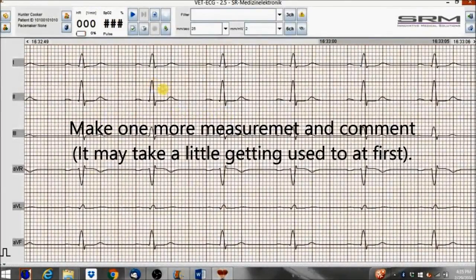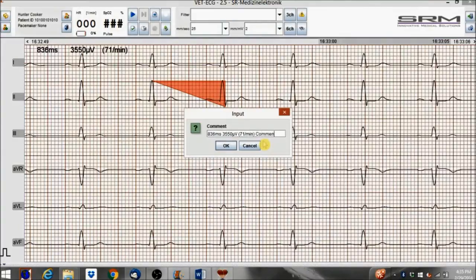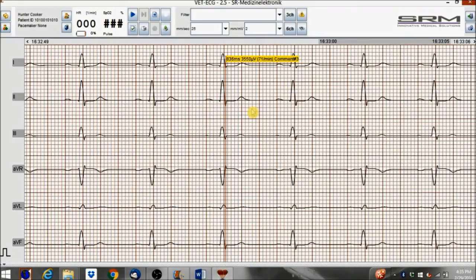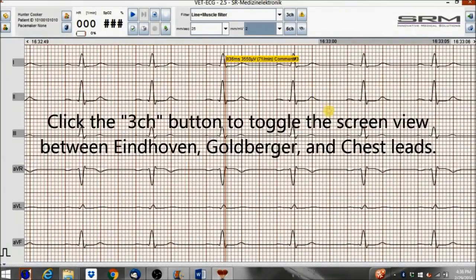Make one more measurement and comment — it may take a little getting used to at first. Click the filter box to apply filters to your recording. You can also use this feature while the recording is in progress. Select line and muscle filter for best results. Adjust the paper speed and signal amplitude — note that this will not affect the recording, only how the recording is displayed. Click the three channel button to toggle the screen view between Eindhoven, Goldberger, and Chest Leads.